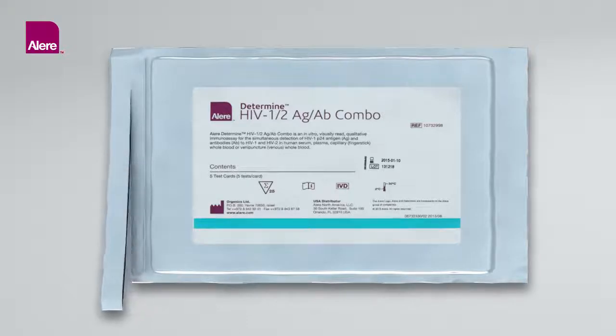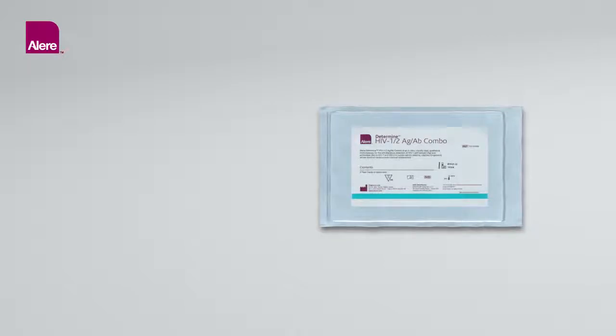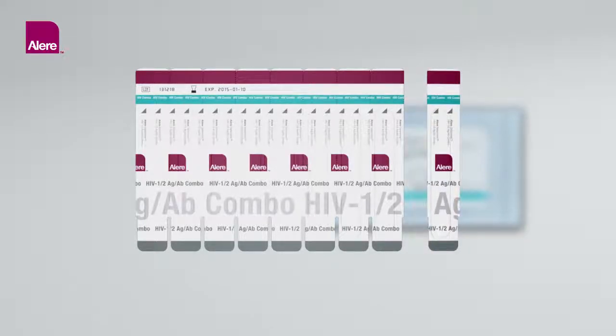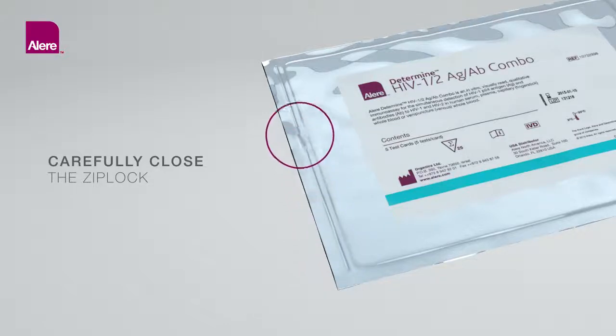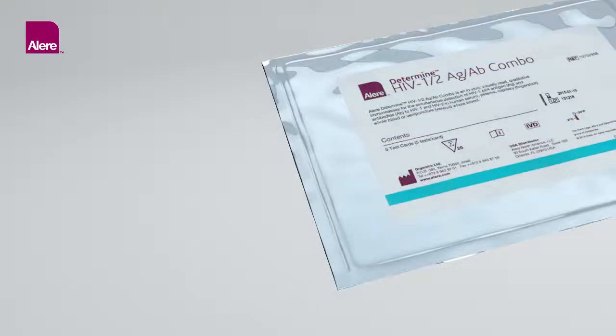Test Preparation: Open the aluminum Ziploc pouch containing the ALIR Determine HIV-1-2 Antigen-Antibody Combo Test Cards. Remove the desired number of test units from the 5 or 10 test unit card by bending and tearing at the perforation. Removal of test units should start from the right side of the card to preserve the lot number, which appears on the left side. Return unused test units to the aluminum pouch, close with the Ziploc, and store only in the aluminum pouch containing the desiccant package. Carefully close the Ziploc so that cards are not exposed to ambient humidity during storage.